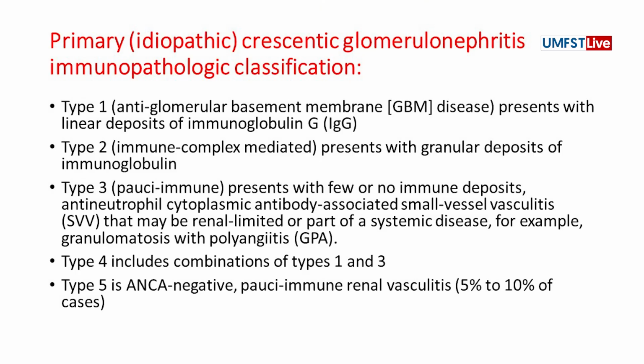There are many types. This is a clinical typing. We say another thing because we are from different planets with the physicians, that's why. Type 1 is anti-GBM disease. There is a linear deposition I saw in immunofluorescence. Type 2, immune complex mediated.